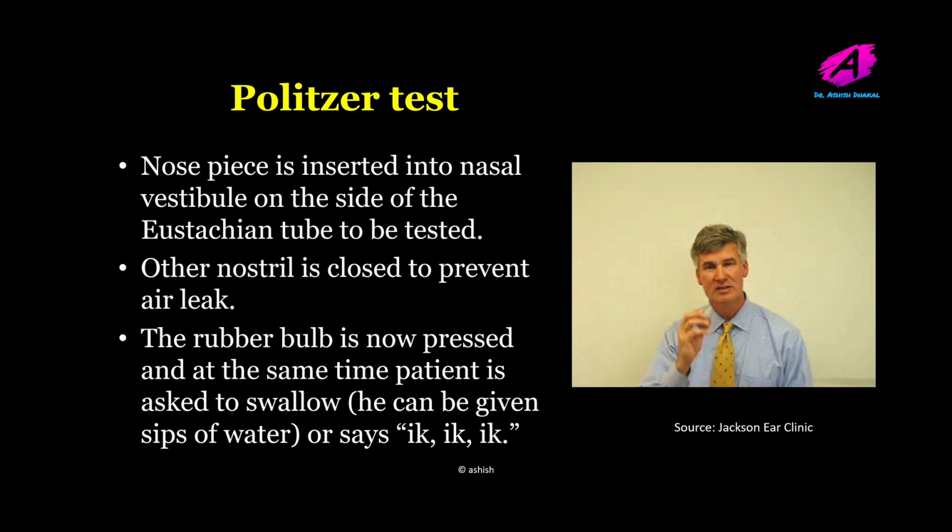So here you can see the demonstration of this test. The patient presses it in its nostril and then presses the rubber bulb. Okay, so the test would be positive, or the Eustachian tube is patent, when there is fullness in the same ear.